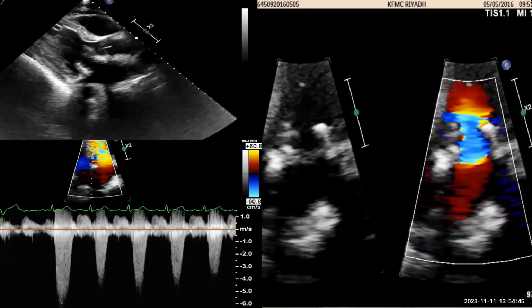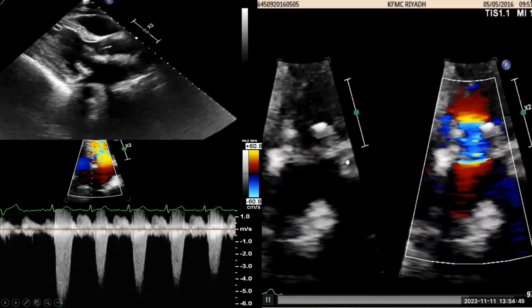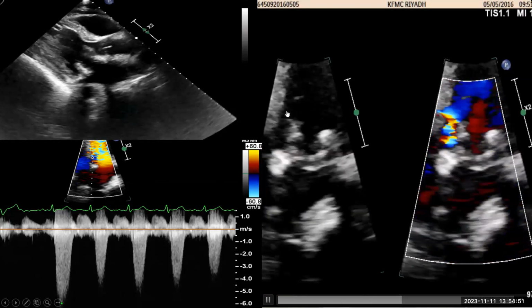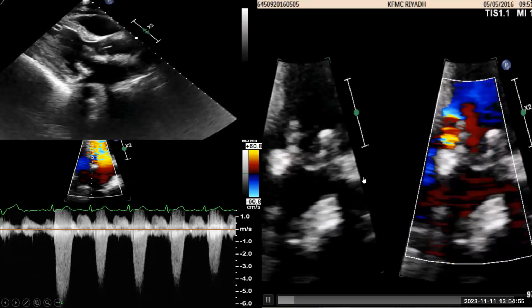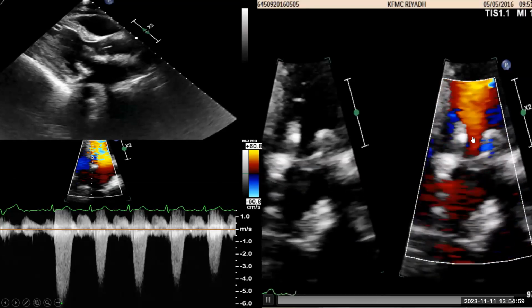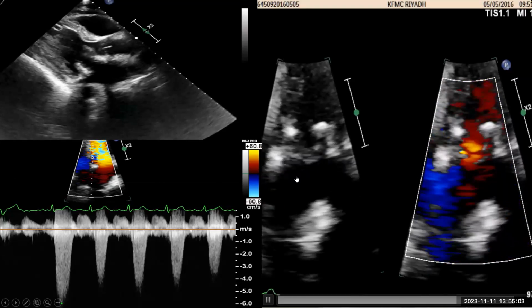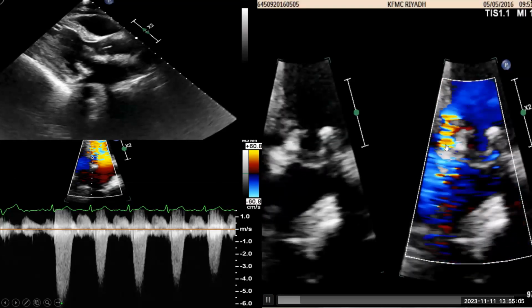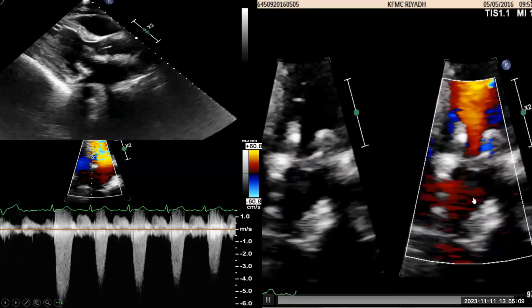Paravalvular leak. So now this is likely a 5-chamber focused view again. I will give you a chance. Do you have any other answer here? This is 5-chamber. This is the LVOT. This is the mitral valve, tissue valve. You can see the thickening of the leaflets, struts. So this is not a paravalvular leak. Why? Because I cannot see anything going to the left atrium.